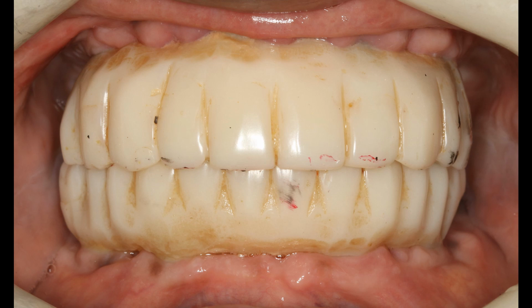As many years as I've done this, I've never had a patient say that, nor have had a patient that has been grinding in front of me at his dental visits. Typically, grinding is a nighttime habit, and this gentleman could not control his grinding at all during the day or night. So we made him mouth guards to wear at night to help protect his temporaries. It got to the point where he had to wear them during the day as often as he could to protect the acrylic.